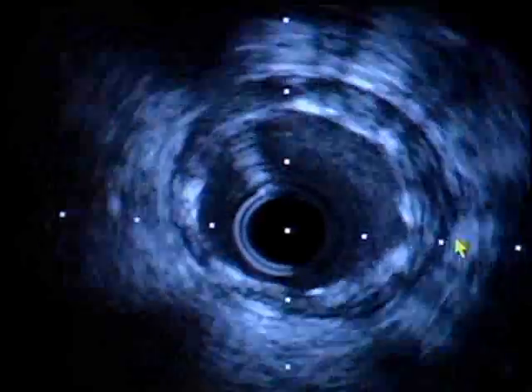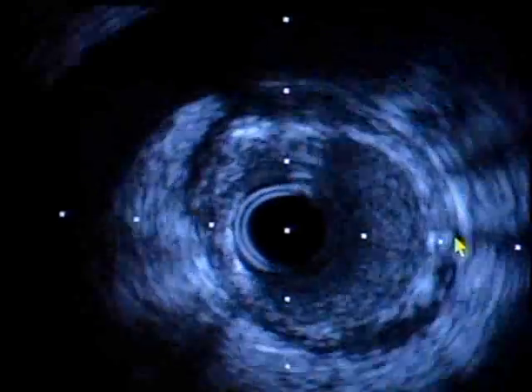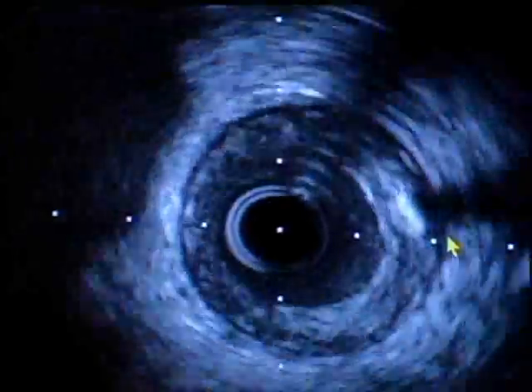Sometimes people get confused that it's under-expanded. If you get a lumen of 6-7 millimeter square throughout and it is touching the stent vessel wall, to me, I think you have finished the work.